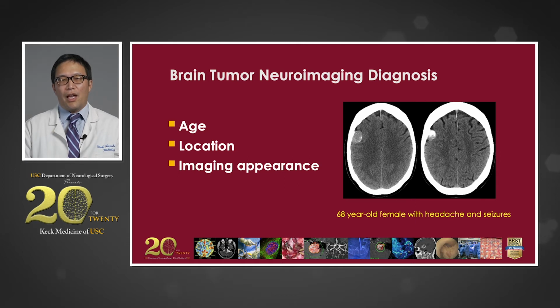But on the right side of the brain, you can see this hyperdense, pretty well circumscribed mass that has some sharp borders, and it is hyperdense or hyper-attenuating compared with the density or the attenuation of the rest of the brain. So it appears a little bit brighter. One slice up on the image to the right, you can see that there are some very bright areas, hyperdense or hyper-attenuating areas that correspond to calcifications.